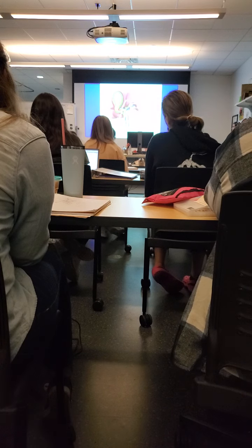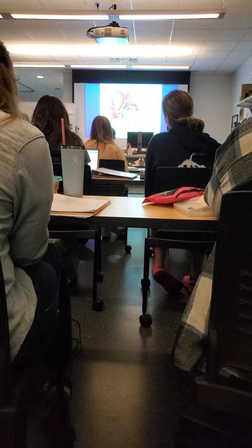So you've got your left, you've got your right. Same thing with your portal, main portal vein. You've got your left here, you've got your right. And your right hepatic artery, left hepatic artery. Seeing a theme here? They all kind of go in and split because they have to supply different portions.